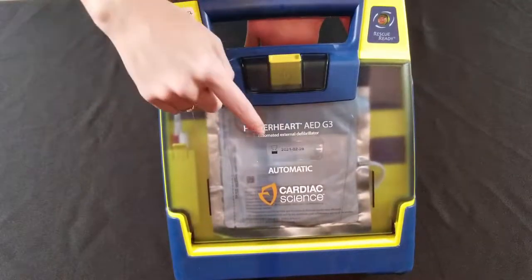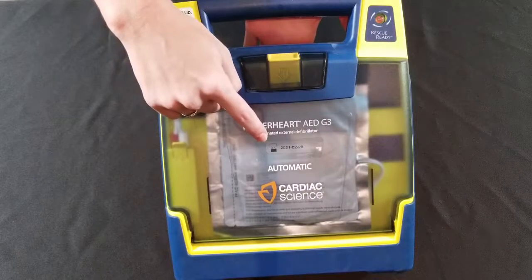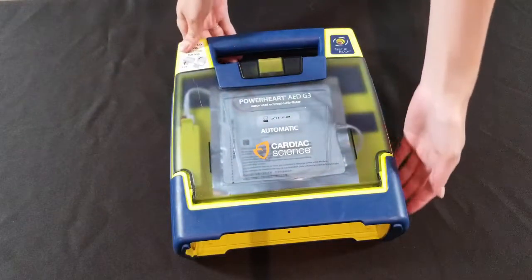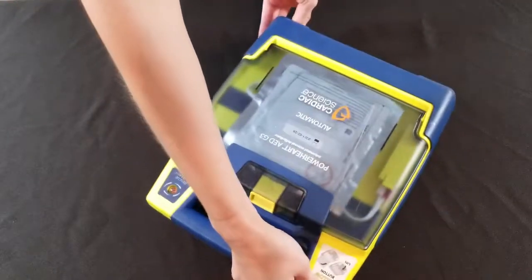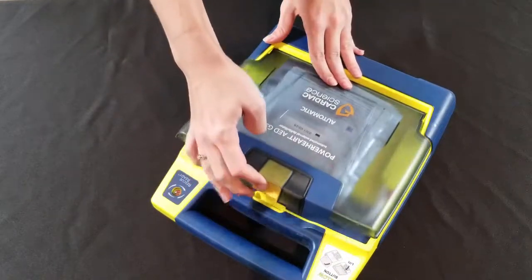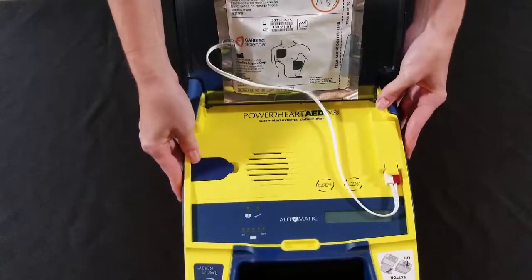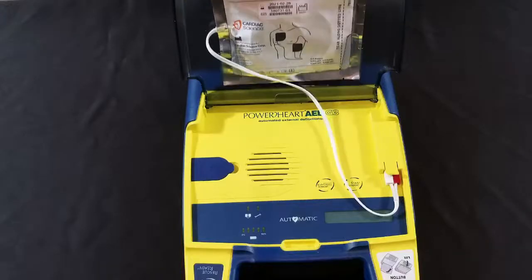You can check to see if your pads are expired by looking at the expiration date right here. If you can't see the expiration date, they might be on the other side of the pads. Open your device by pressing this yellow button and lifting the lid. Then slide the old pads out.